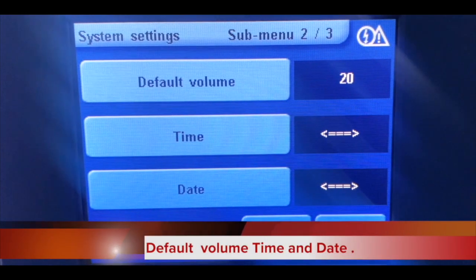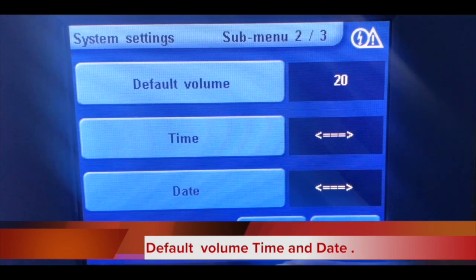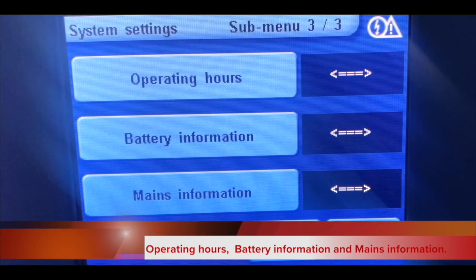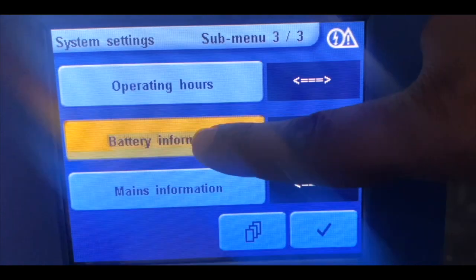On the second page you will get the option of default volume, time, and date. On the third page you will get the option of operating system, battery information, and mains information. Now you have to press on the battery information option.